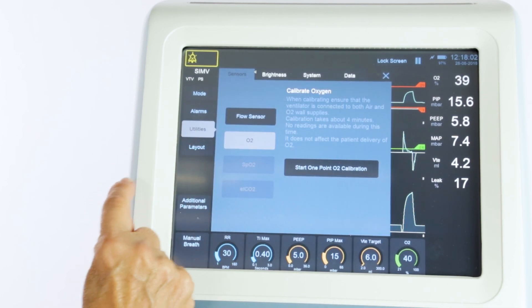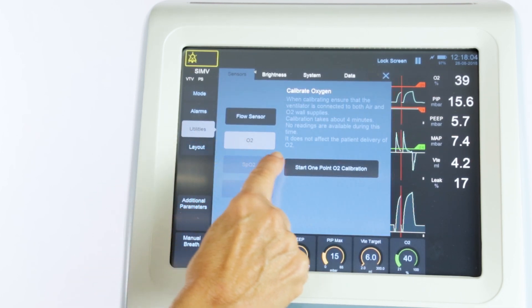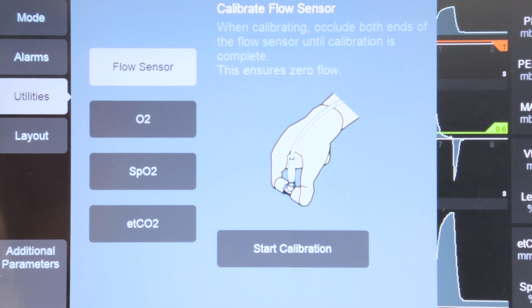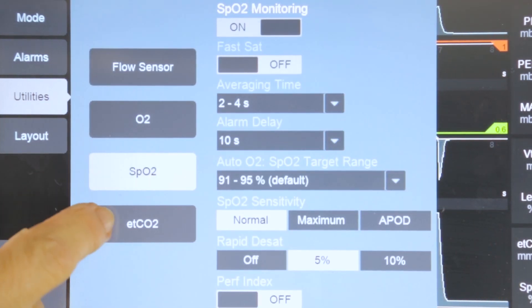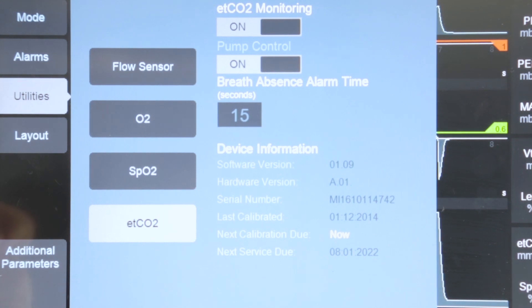The Utilities menu opens a page that allows you to calibrate the oxygen and flow sensor. If SPO2 or Entidal CO2 are installed, control buttons for these functions will also be available.